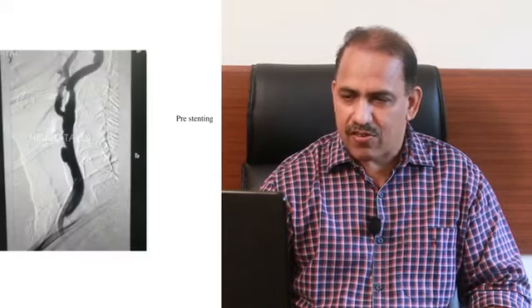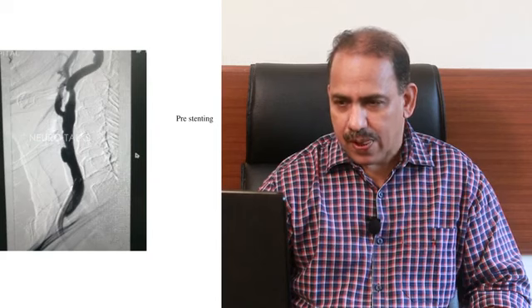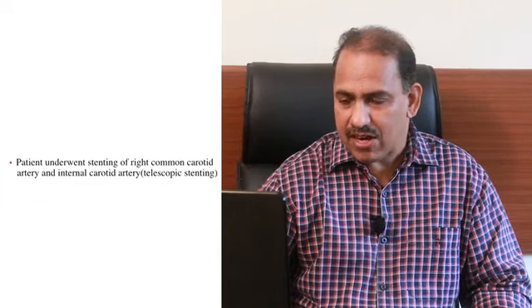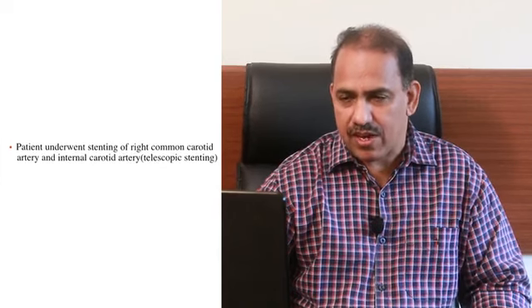This is the unsubtracted view — this is pre-stenting and this is post-stenting. The patient underwent telescopic stenting of the right common carotid artery as well as the internal carotid artery, and on follow-up she never had any recurrence of the TIAs.